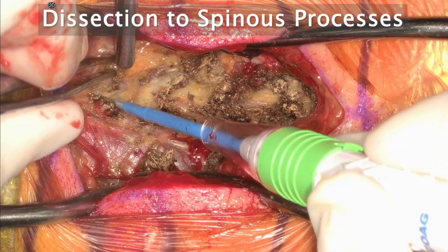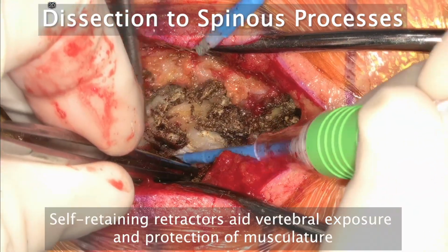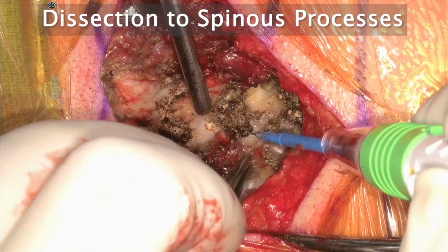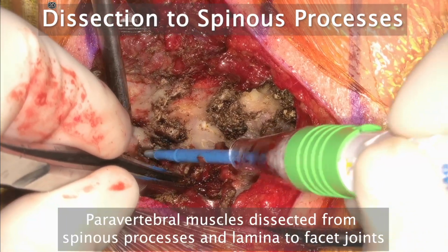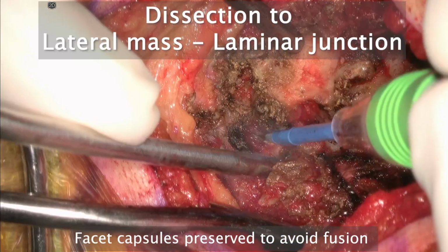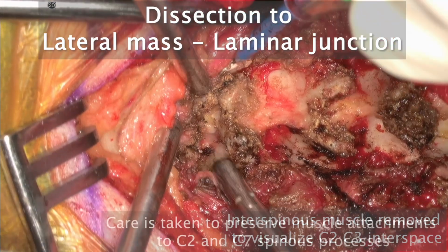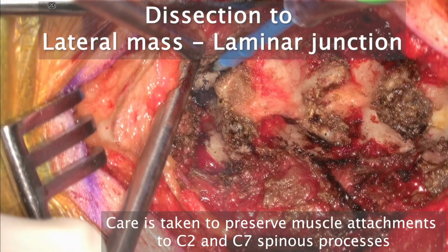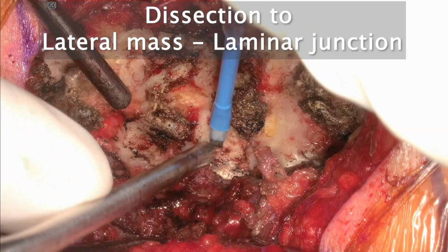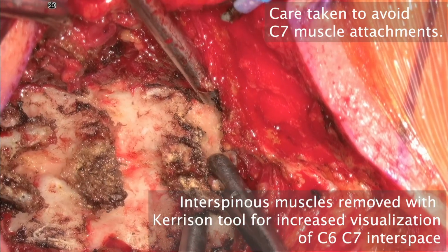Absolutely. Right now we're looking at the spinous processes that have been exposed. Using that monopolar is, again, allowing us to minimize that blood loss. I think it's important to note that in laminoplasty, you don't have to leave a large cuff of tissue in the midline because it really does not provide any sort of support. The most important thing from a surgical standpoint is to not disrupt the insertion of the extensors on C2 and C7. Exactly. We can dissect out to the lateral mass laminar junction, but not beyond, so as to not disrupt the facet joints. After doing this, tell me what is going to be the next portion of this operation.